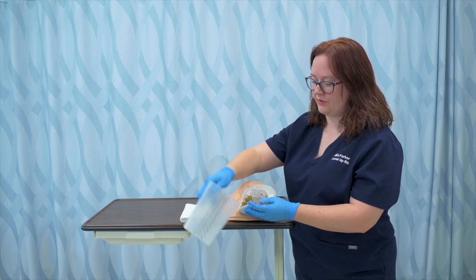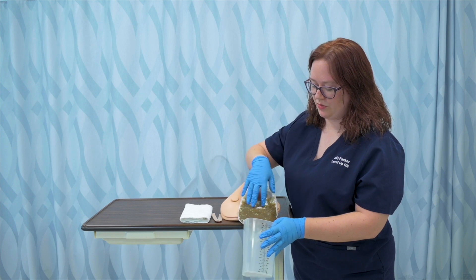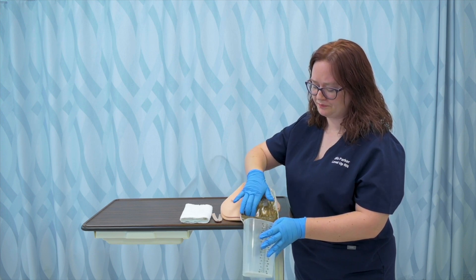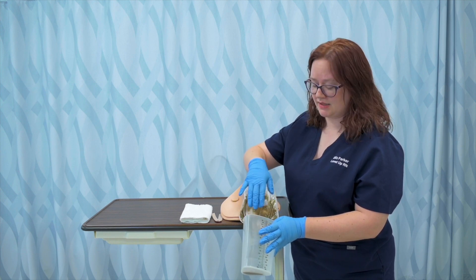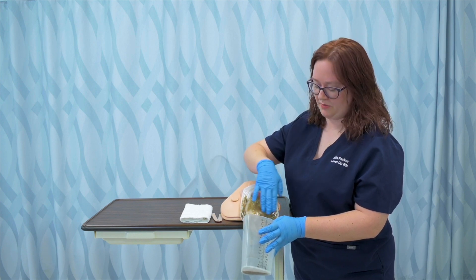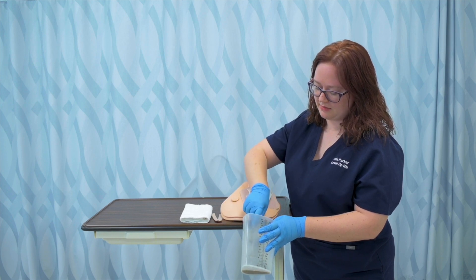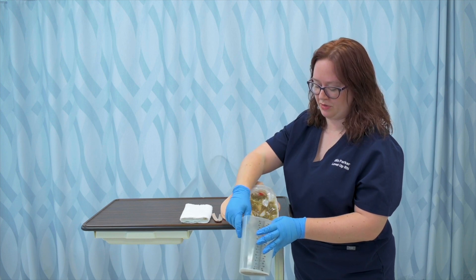So I'm just going to make a little cuff there and I'm going to allow it to drain into a graduated cylinder — you may need to encourage it to exit. I could also use a bedpan for this, or if my patient were ambulatory, they can do this over the toilet or commode. I'm going to just empty it out as much as I can.